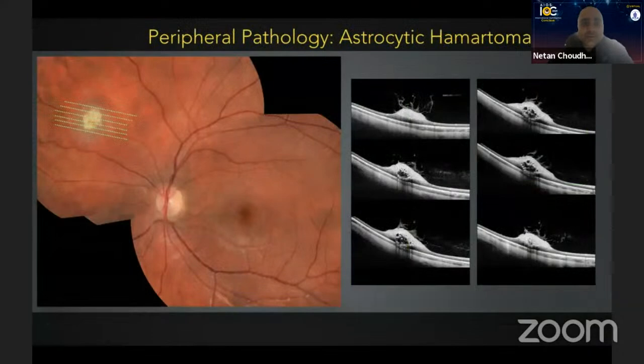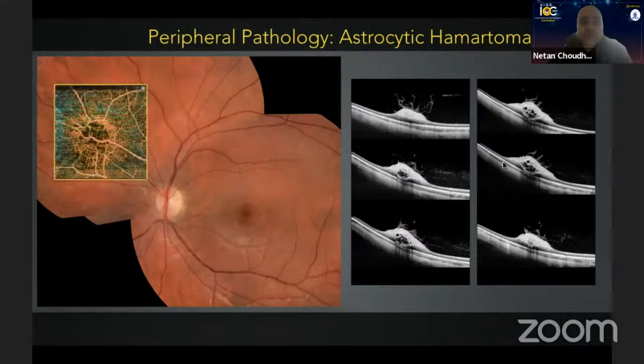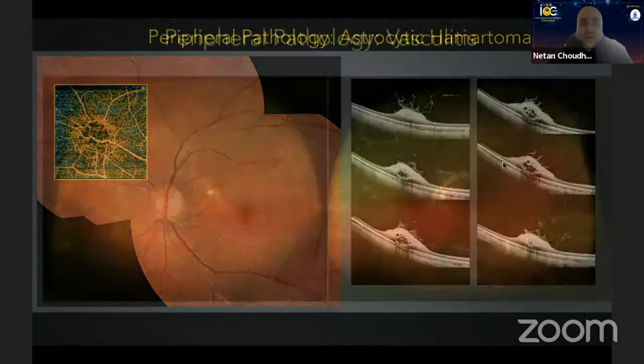And as I mentioned earlier, OCT angiography is expanding its field of view also. We now have the ability to do 24 by 24 millimeter scans, and with the newer devices, we're able to go out as far as the mid periphery on average to get good OCTA. The far periphery still remains a challenge at this time.